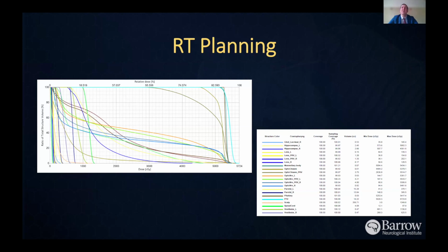It's really not an exception, but one of the things that we use quite frequently, especially in acromegaly, is something called gamma knife. I won't bog you down with too many details of why the planning is shorter, but it's the one where we can do the planning session and the treatment usually the same day. But it still goes through all these checks. Anyway, there's at least some amount of time between the simulation and actually delivering the radiation to make sure all these things are met.